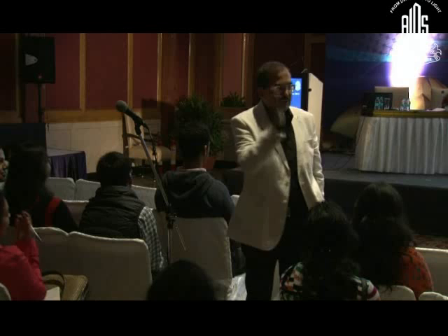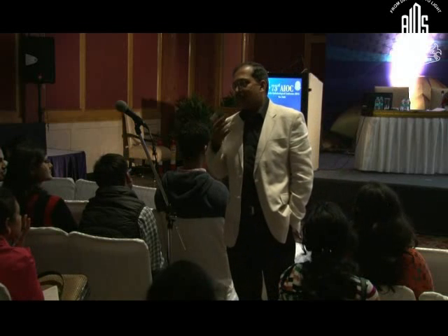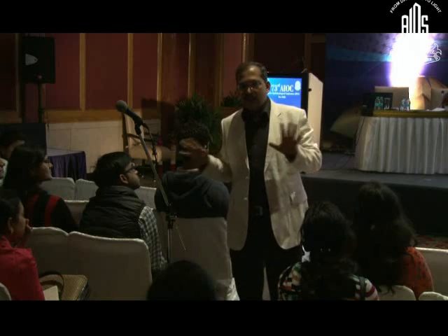Okay. So these are accommodative lenses, where there is a forward shift of the optic within the eye. What is the most commonly used accommodative lens that you know? Crystalens from Bausch and Lomb. Okay, the last one is about LASIK. We'll finish with LASIK because that is going to be everything for us tomorrow.